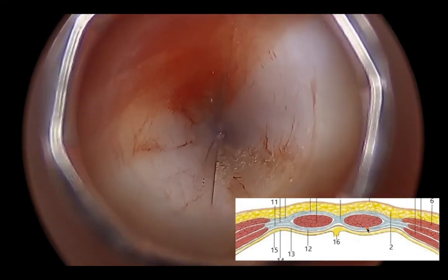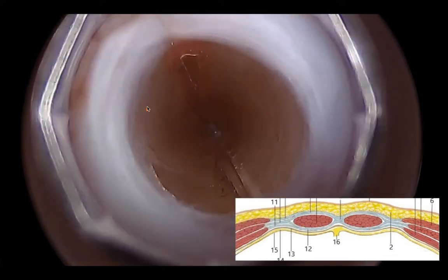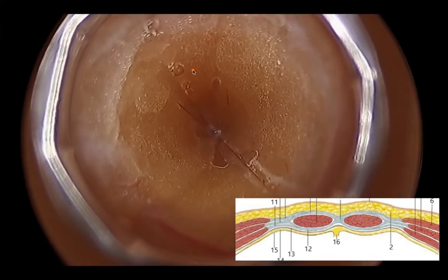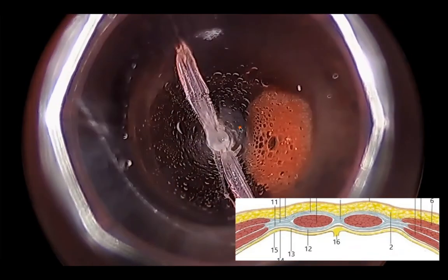Keep going, twisting. Now you see the posterior sheath more distinctly — we're resting mostly in the posterior sheath. Then we see that sheath fully split, and we're seeing what is probably intraperitoneal fat — probably the omentum. It's pretty rare that you see all these distinct layers once you get past the posterior rectus sheath. My suspicion is that because there's not much structural strength in those layers, as the trocar pushes through it separates the preperitoneal fat out to the side. So often you'll see anterior sheath, rectus muscle, posterior sheath, and then just pop through the peritoneum and be intraperitoneal — as we're seeing here. This is omental or intraperitoneal fat, and the surgeon removes the optical part of the trocar and starts insufflating having safely entered the abdominal cavity.